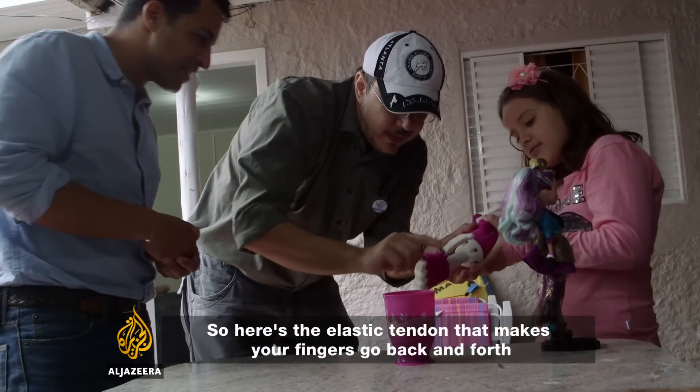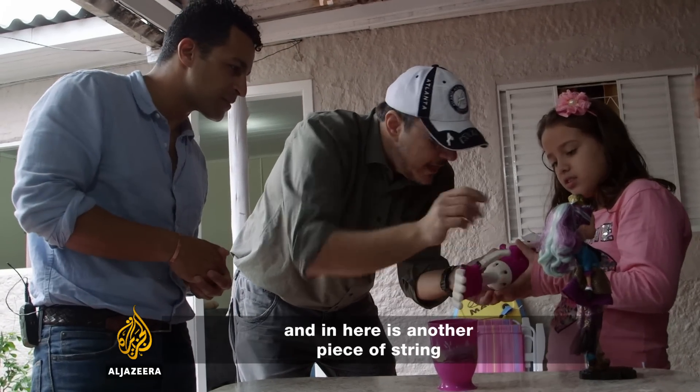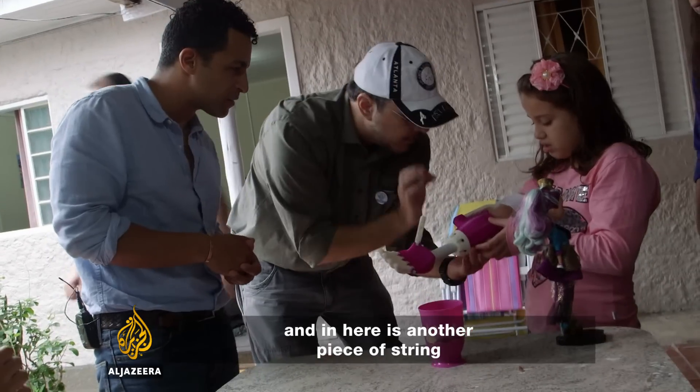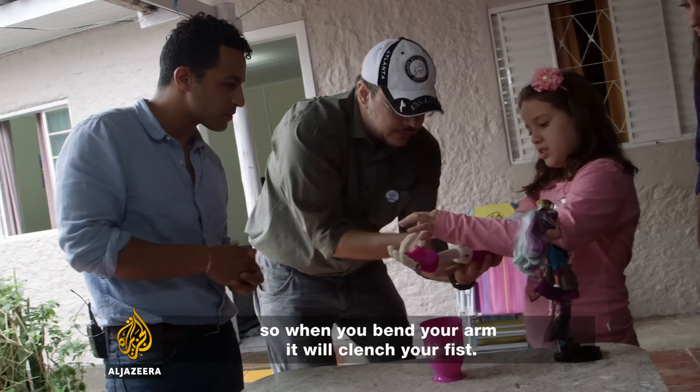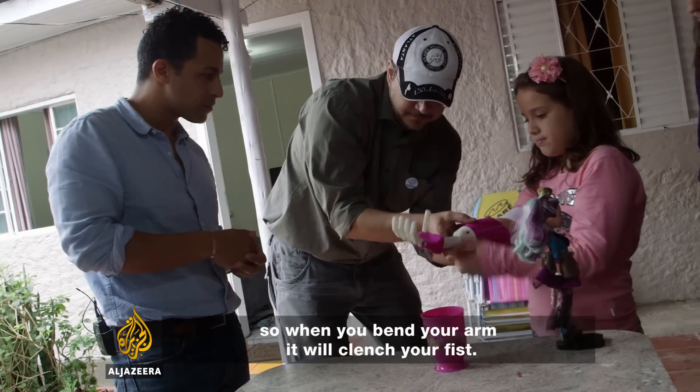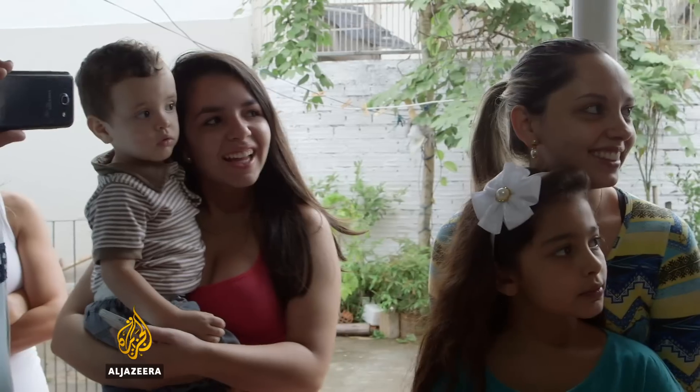Here there's an elastic tendon that makes the fingers return, and inside there's another cord which, when you bend the arm, closes the hand. See how it works? She's getting better at it, isn't she?